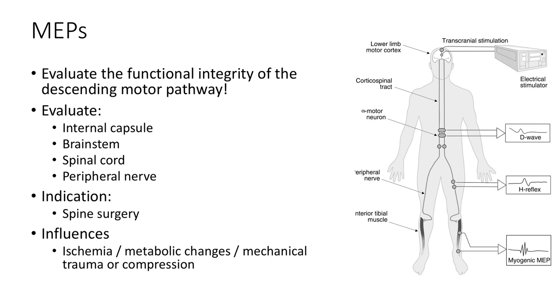But since the patient will be actively moving, stimulation and vigorous contractions can cause tongue lacerations due to masseter contraction. So those patients need to be fitted with a bite block. And you cannot use neuromuscular blocking agents, obviously, for this modality. If there are abnormal MEPs, same thing as with SSEPs: rule out ischemia, metabolic changes, mechanical trauma, or compression. You should not use this monitoring modality on patients who have epilepsy, cranial defects, cortical injuries, implanted intracranial devices, or have an increased ICP.